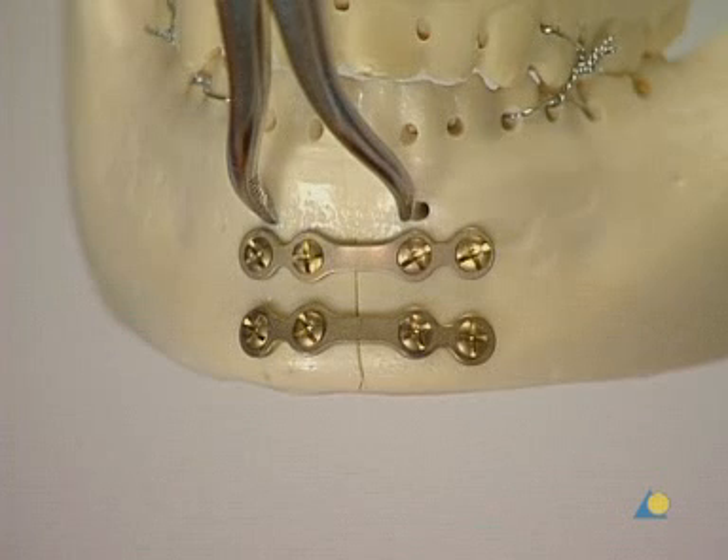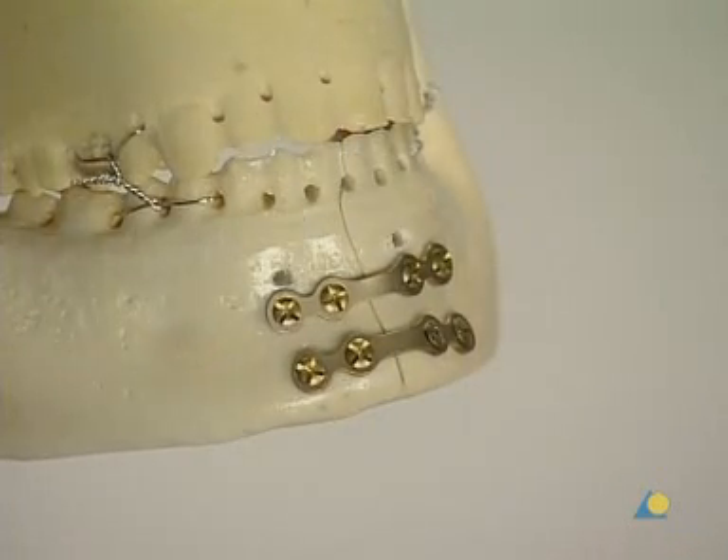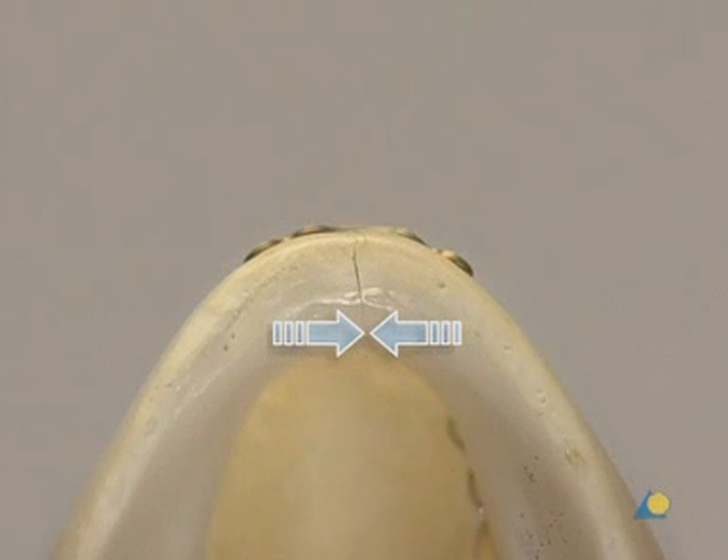A second 2.0 mandible mini-plate is now used. This plate is placed under the tooth roots to avoid damage. The reduction forceps is removed. It must be confirmed that the reduction is adequate and fixation is complete, and that no gapping exists on the lingual aspect that would lead to occlusal disturbance and mandibular widening.